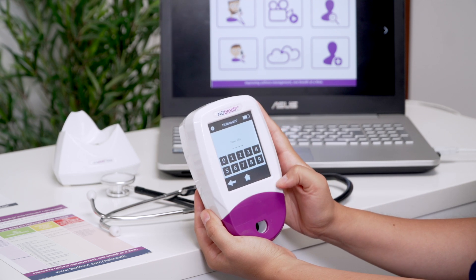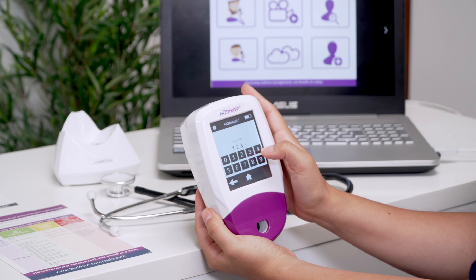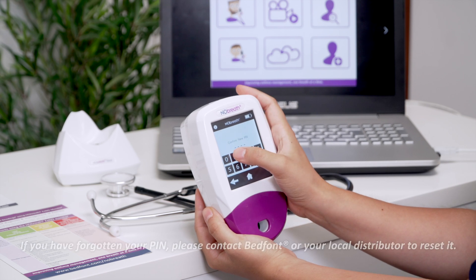Enter a new four-digit PIN and press Next to continue. Re-enter your PIN to confirm the new four-digit code and press the tick to save.